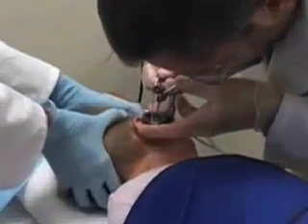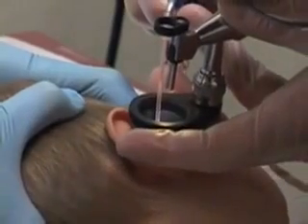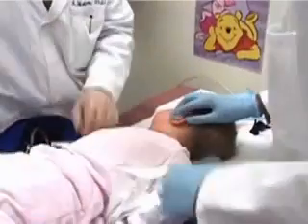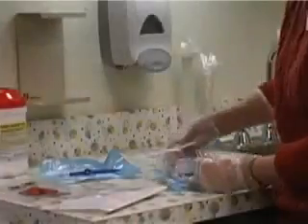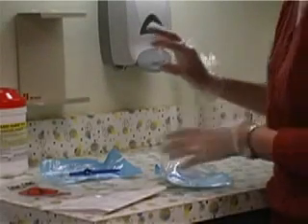Use a second aspirator with flexible tubing to suction any remaining blood and pus from the canal. Place a small cotton pledget in the external auditory canal to absorb any remaining blood or pus, and release the child from the restraint. Remove the plastic receptacle from the tympanocentesis aspirator, cap it, and send the specimen for microbiologic evaluation.